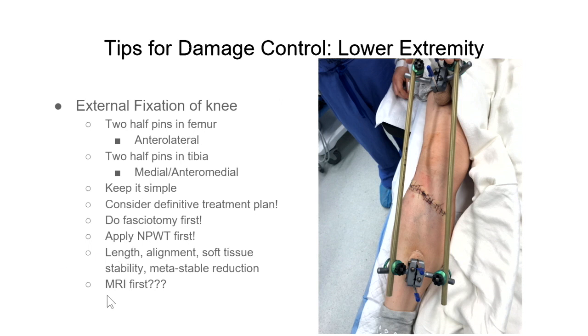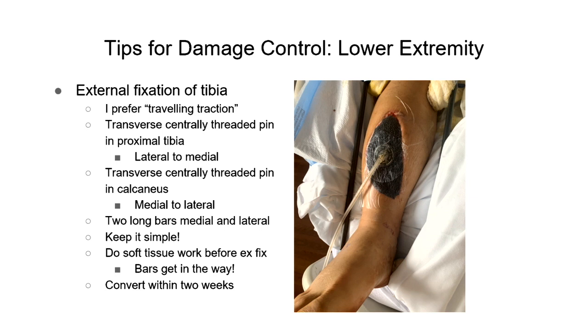And this came up at some point. It was just a thought. These things are not considered MRI safe, according to the FDA. They're called MRI conditional, and it's a four-hour conversation with somebody about whether they will or won't get an MRI. If for some reason somebody somehow somewhere needs an MRI, think about getting it first. If it's a brain MRI, if it's a knee MRI, if you Google Stryker wall chart for radiologists, there's a document that'll come up that'll explain everything about an X-fix to a radiologist that they need to know, all that gobbledygook. So it's one of those things that'll come up. It's my thoughts. Try to do it first.